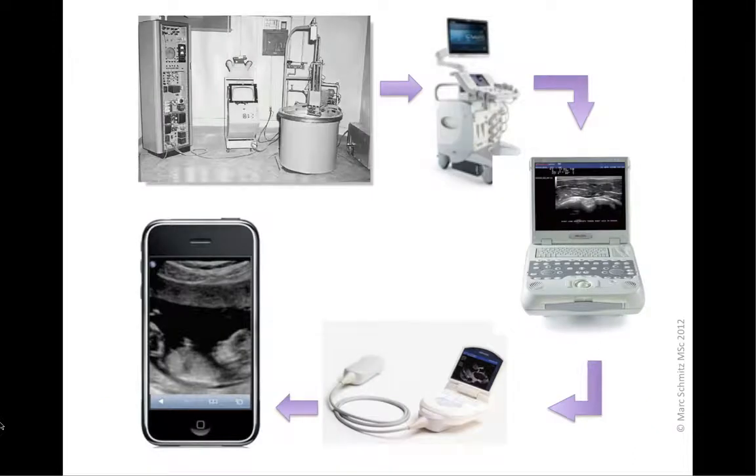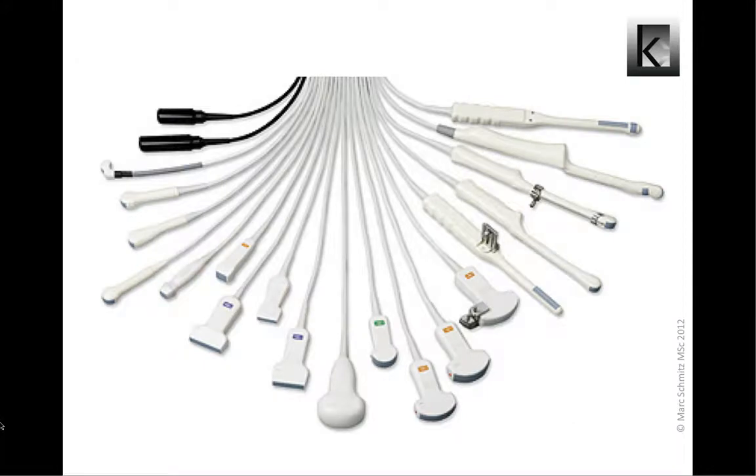Ultrasound technology is rapidly advancing and being refined and is aimed at both increasing image quality and opening new fields of applications. So what equipment do we need for MSU? First of all, we need a transducer. Transducers come in various shapes and dimensions. Small transducers for the smaller body parts, convex transducers for abdominal ultrasound, thin long transducers for intra-cavity assessments, and the straight linear transducers we generally use in MSU.